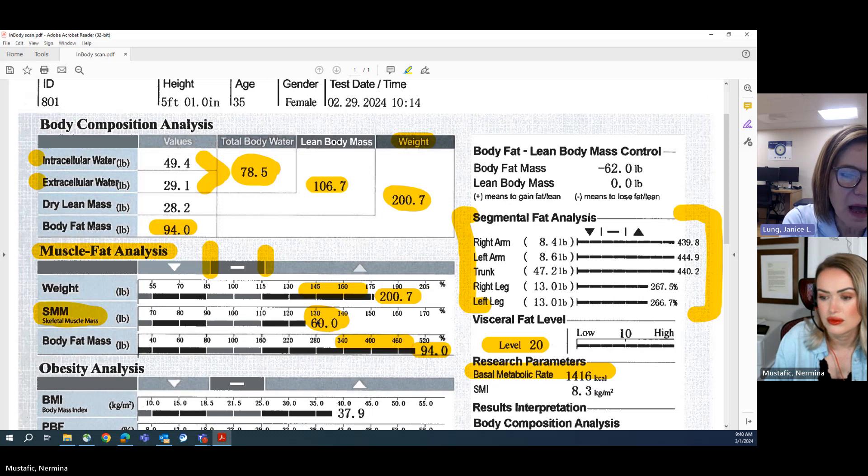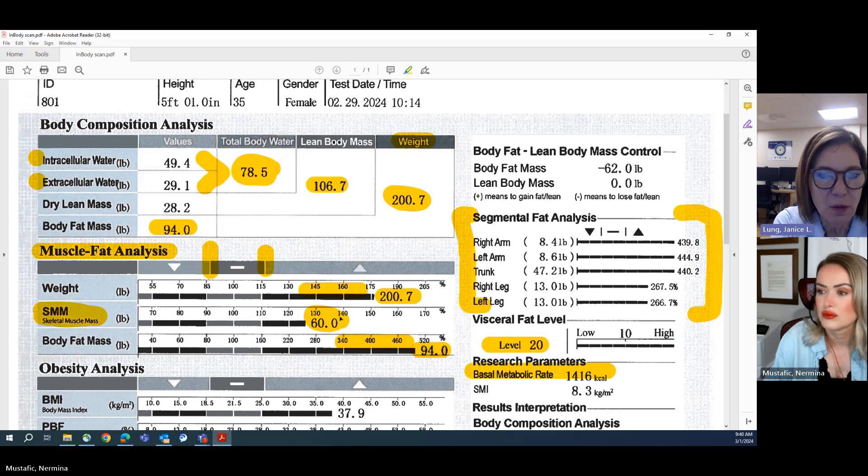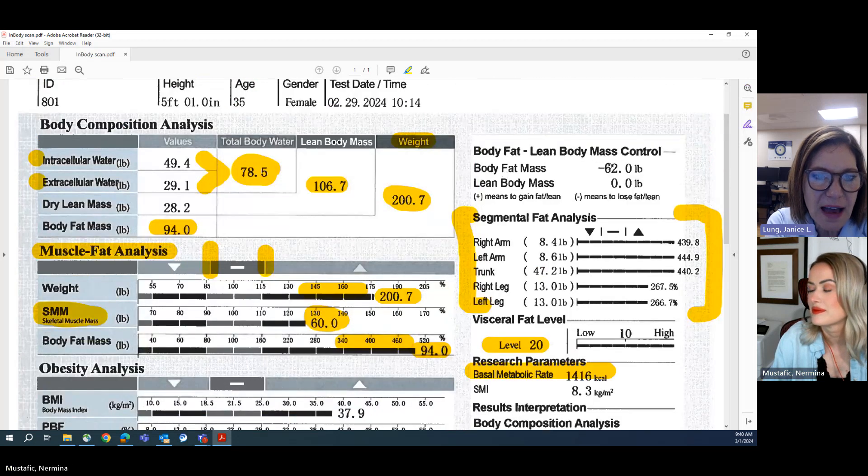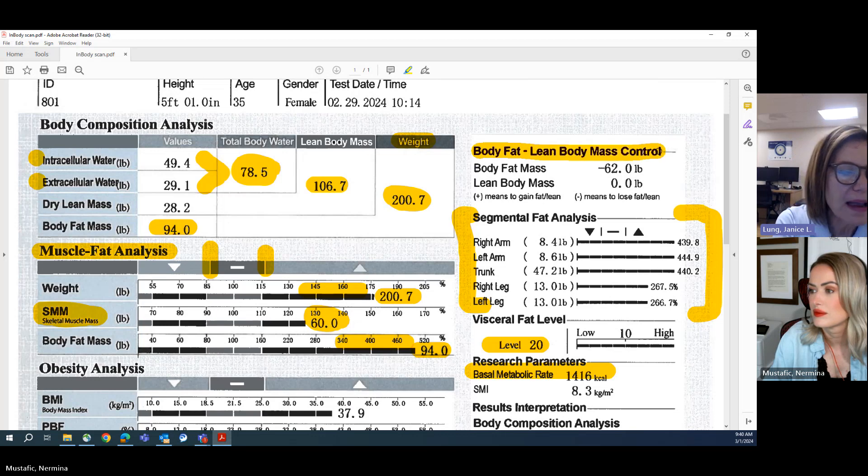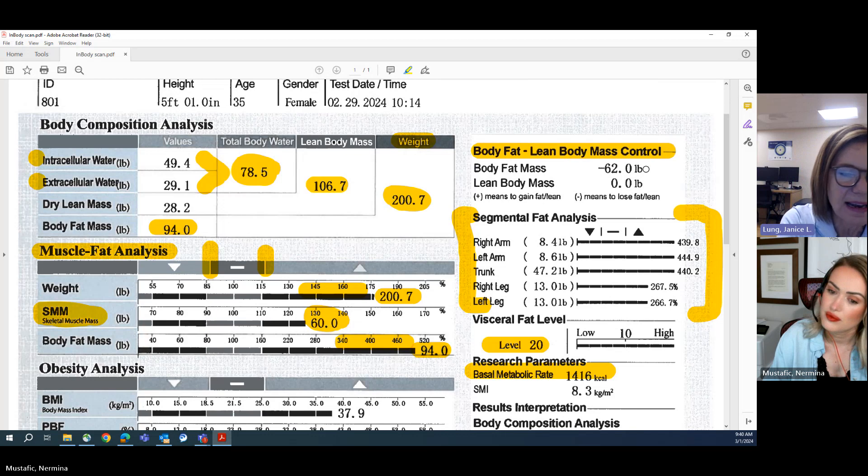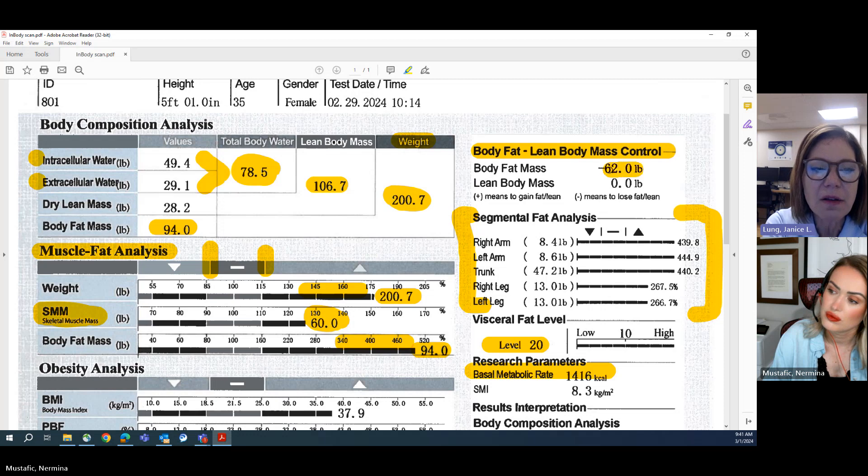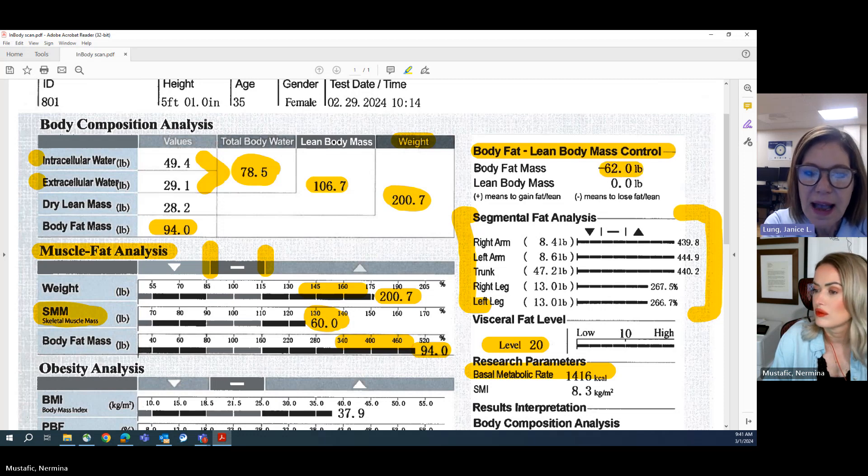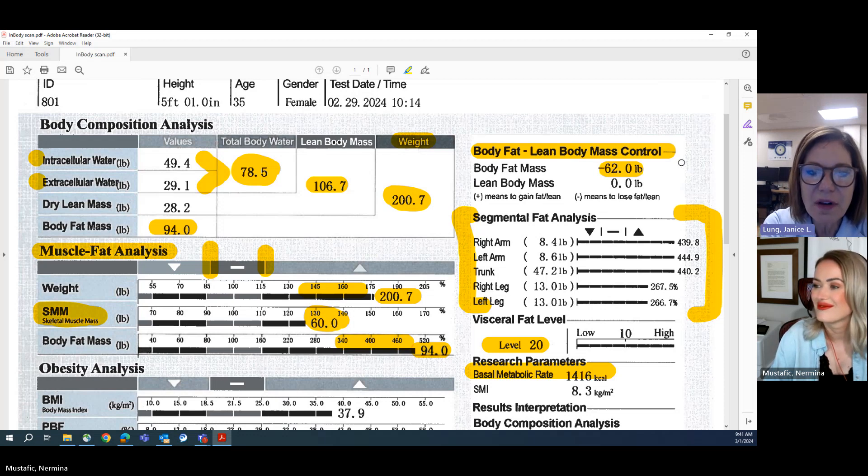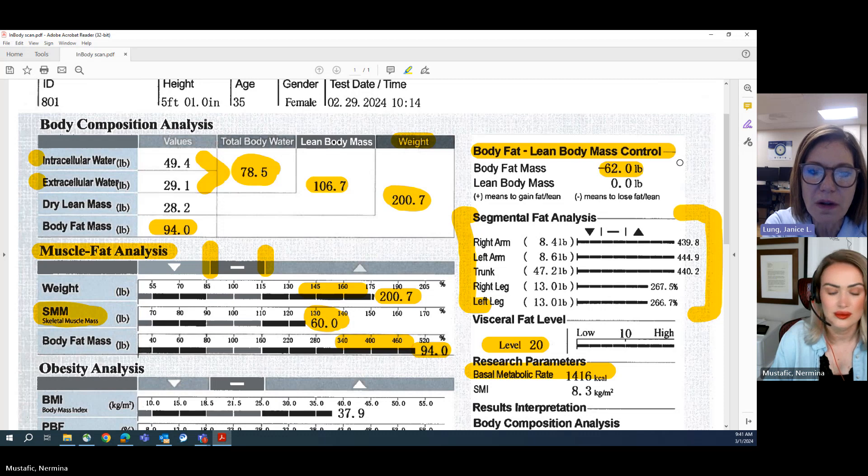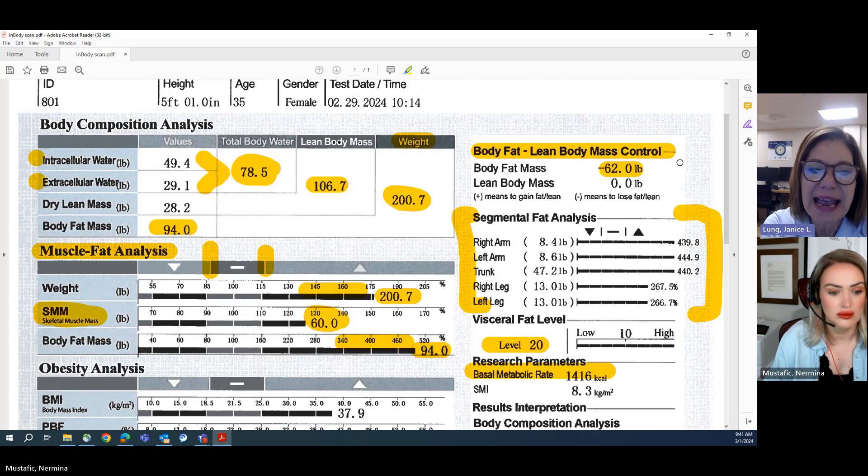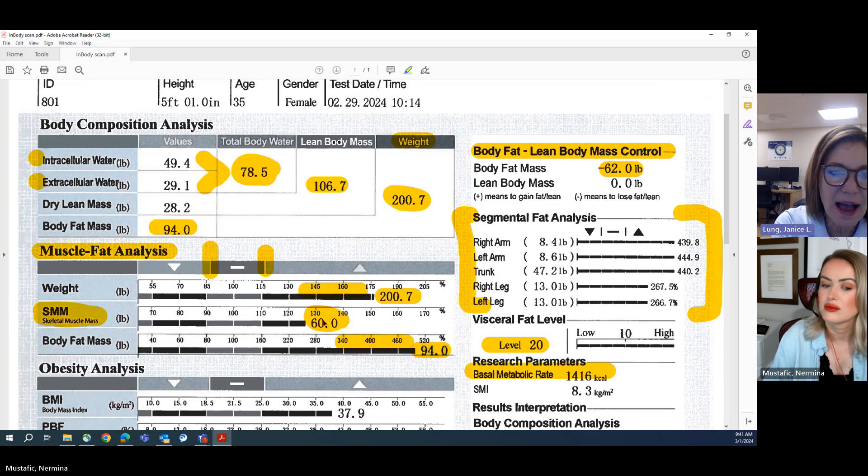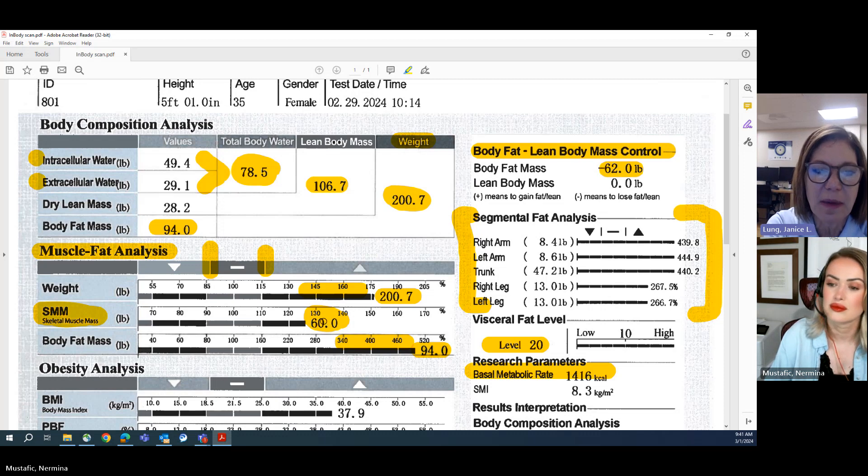We're going to zip on up, up to the right here, and we're going to look at that body fat to lean mass body control. So based on this person's body composition and muscle-fat analysis, InBody here is recommending that this person focus her efforts on losing fat mass. And there's her long-term goal. That's not going to be a goal for this month, not a goal for this employee wellness challenge, not even a goal for this year. This is a long-term goal. This person is going to be working towards a goal of losing 62 pounds of fat mass. And there's no recommendation to gain lean mass. We saw earlier, this person has a beautiful, incredible amount of skeletal muscle mass. So there's no recommendation to gain muscle mass.